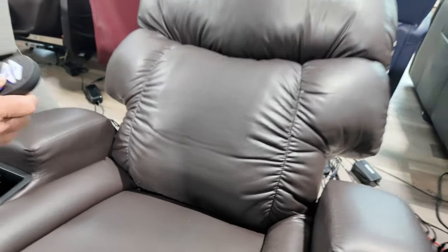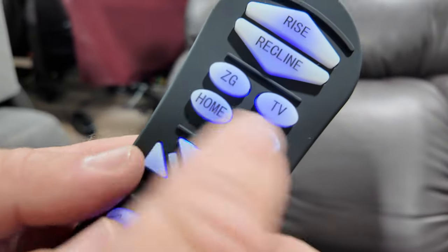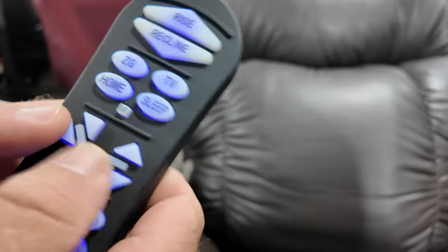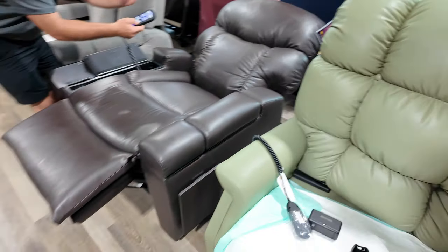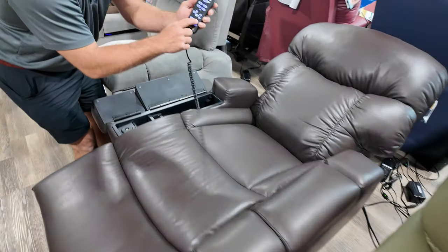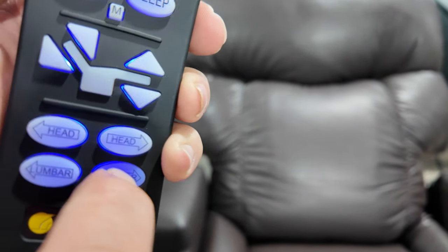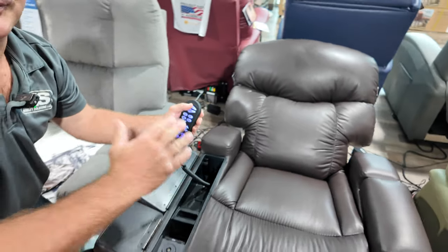And you can change this — memory button — change it to whatever position you like. You have memory settings, pre-settings currently. But if you want to make it flat, do Trendelenburg position, drop the base — you can do a lot of different movements with this chair. You also have the power pillow, you also have the lumbar. And of course every chair I'm talking about has the lift — it lifts you up.